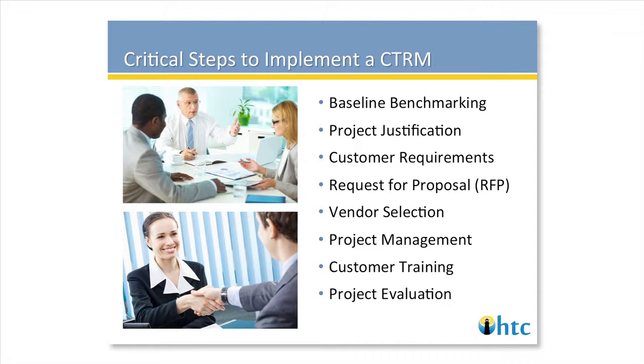Once the system is in operation and it's been used for some period, maybe 3 months, it's always interesting to go back and do a project evaluation and see, did you achieve what you wanted to achieve, and compare back to the baseline that you established prior to starting the project and see if you met your goals. You may then want to do some additional fine-tuning, maybe set some additional goals that you'd like to achieve as well.